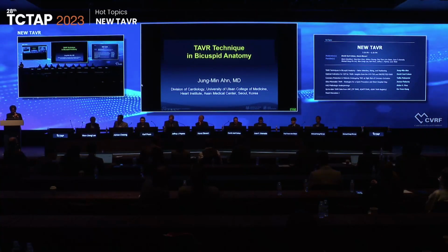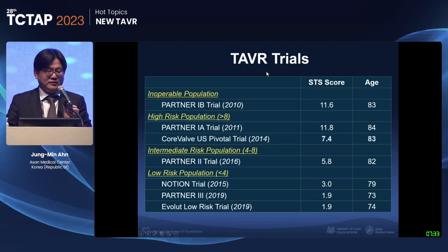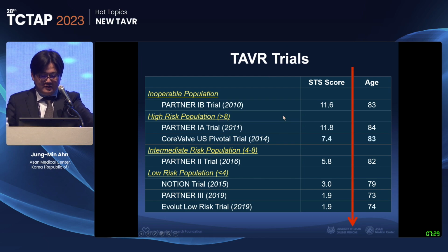Thank you, Chairman. I am Jung-Min Ahn from ASAN Medical Center. I'd like to talk about TAVR techniques in bicuspid valve, using the SAPIEN valve. The first TAVR was actually done in a bicuspid valve around 20 years ago. However, in the TAVR trials, bicuspid valve was excluded.